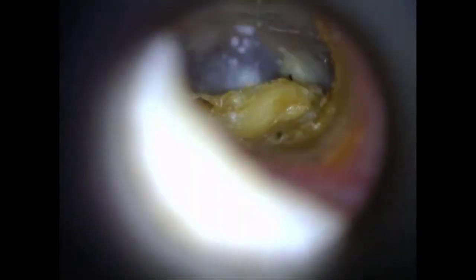As we toggle the rotary dial found on the side of the unit, we can also change the focus as well as magnification, focusing in on things that are a little bit closer as well as further away from the scope.